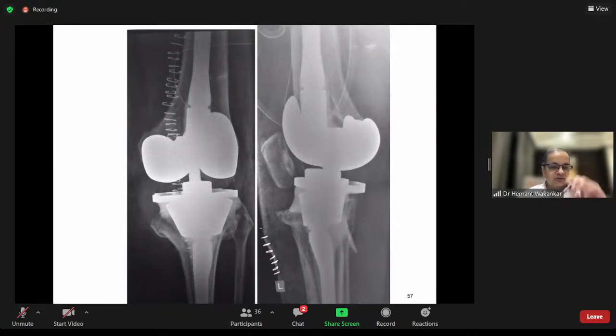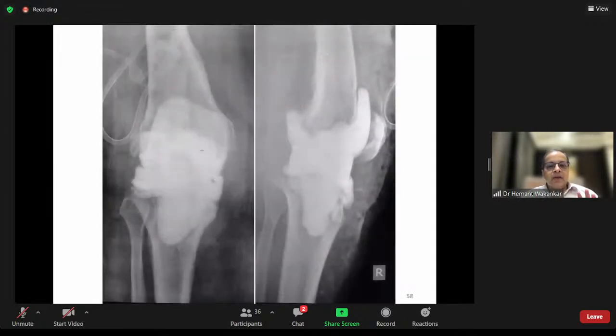And because it gives a good diaphyseal fixation for the prosthesis, it has to be considered as a bone substitution option, and it gives excellent scratch fit abilities.